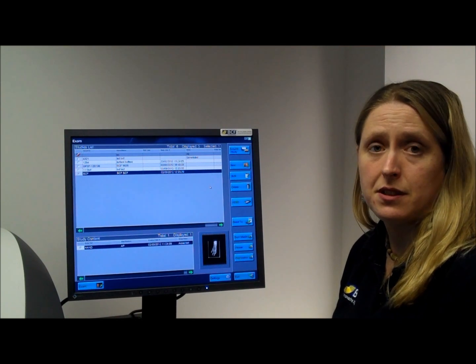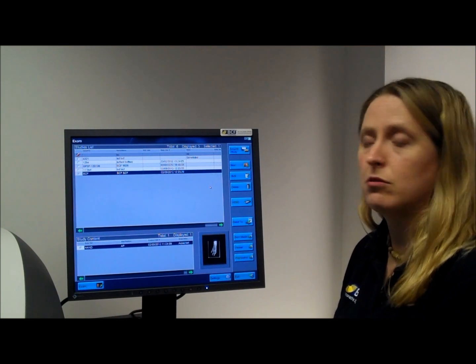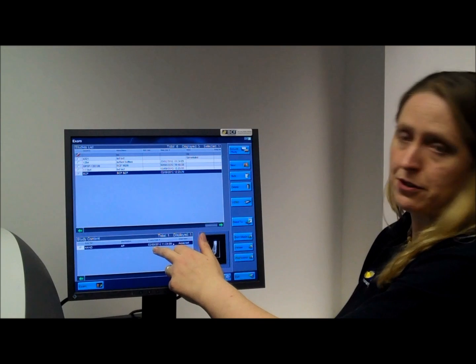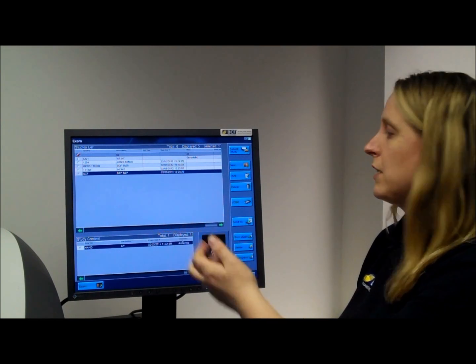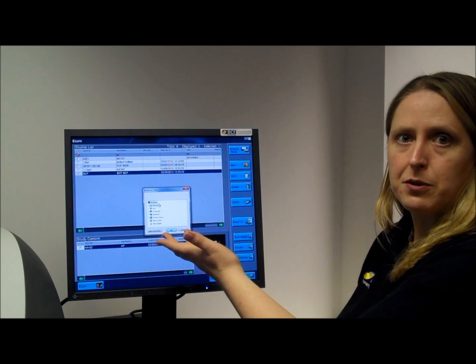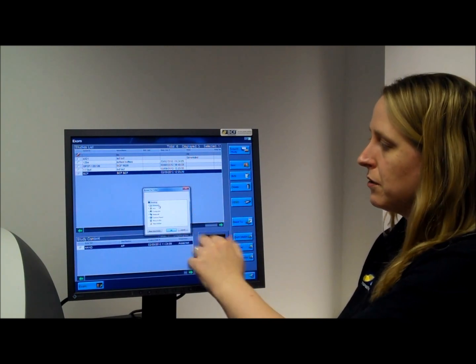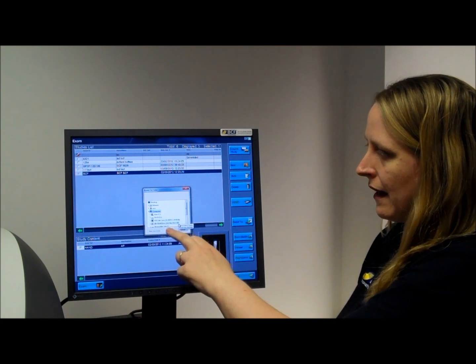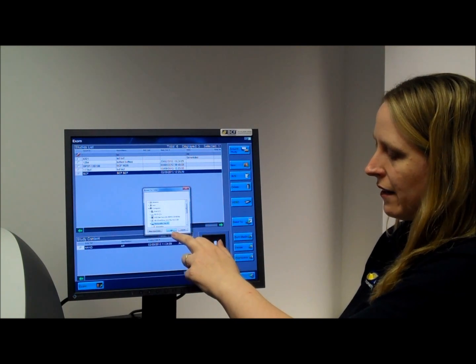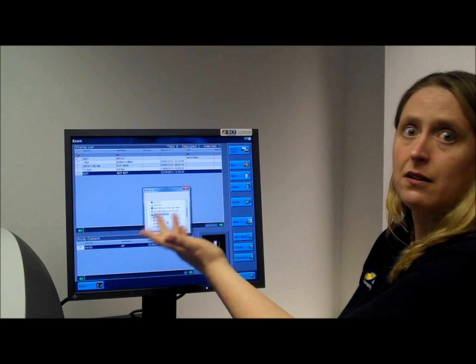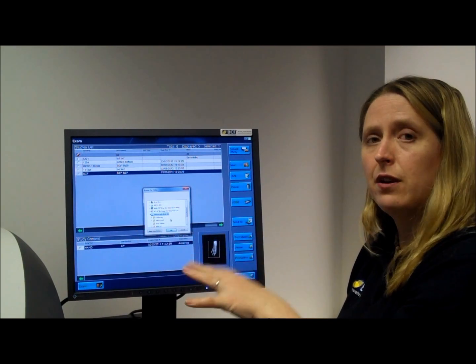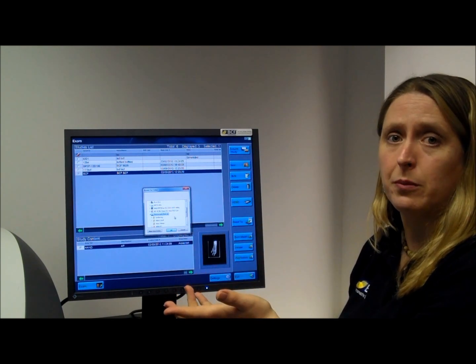If you want to export images as DICOMs onto a memory stick or onto another location within your network, all you need to do is highlight the patient and the pictures you want — you can highlight multiple patients — and go to send to, and group images. You'll then get a folder box pop up from your computer; select your computer, locate your removable disk, and click OK. You can make a folder on there, naming it however you want, and then export the images as DICOMs. If you have a lot of pictures, this can take a little while because they are very large format.